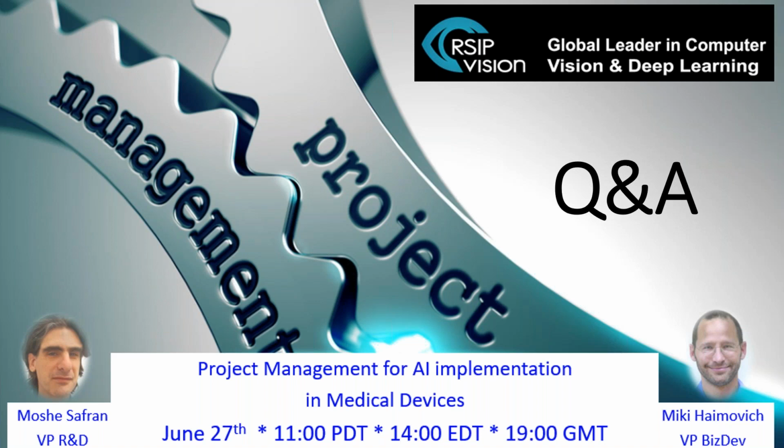I'll just say two things. The first one is that in order to start the process, you don't need so many samples. For the POC, you don't need many samples, and with not too many samples, we can still develop for you an AI solution that would be sufficient. So that's one thing. The second thing is that that question often comes along as we plan the timetable or the timeline for the project.